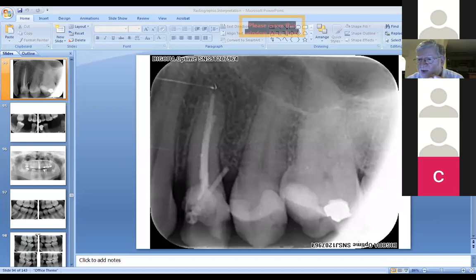Look at the space that you have. See where the opposing cusps are biting in where. And then you are pre-warned. And then go cautiously after that.